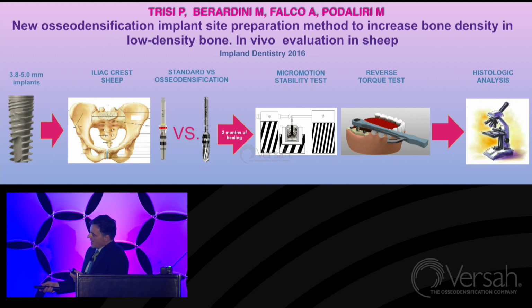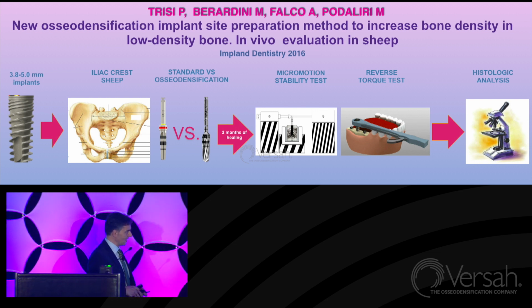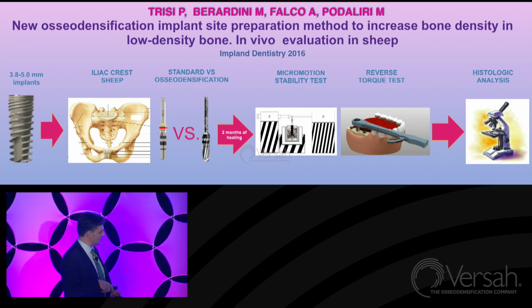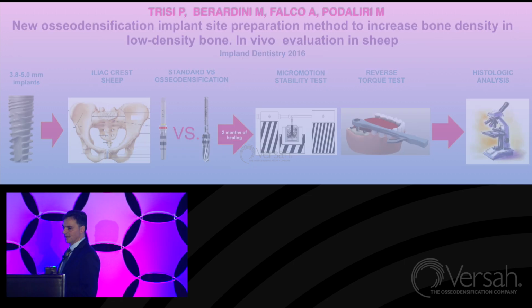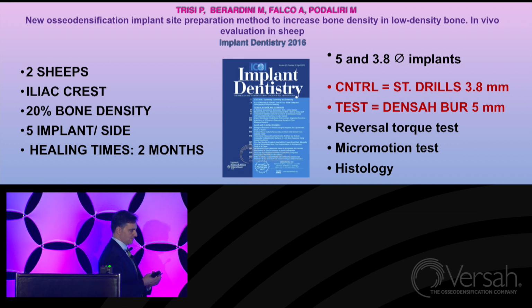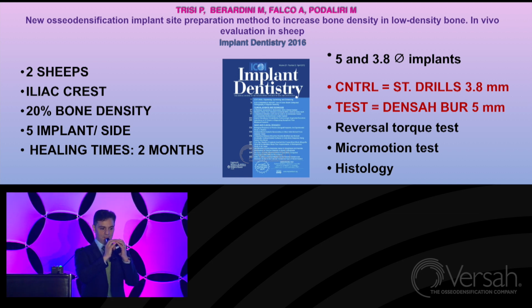So what we did was, again, the same model in the iliac crest of the sheep. We compared standard drilling versus densification, with 2 months of healing. After healing, we did the micromotion test, the reverse torque test, and histologic analysis. This is the model: two sheep, iliac crest, 20% bone density, 5 implants on each side, 2 months healing. We were supposed to place implants 3.8 or larger if possible, because the crest was between 4 and 5 millimeters.